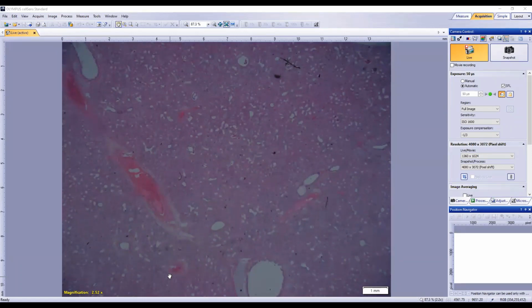Now this is a slide that we will be limited if we stick at this view forever and ever. So we will end up going in a little bit closer. But first, I want to narrow down some particular features that we're going to go in closer and confirm. Now this was tissue from a foal, wasn't it, Shubo? Yep. So there are some processes that we can rule out straight away, aren't there?